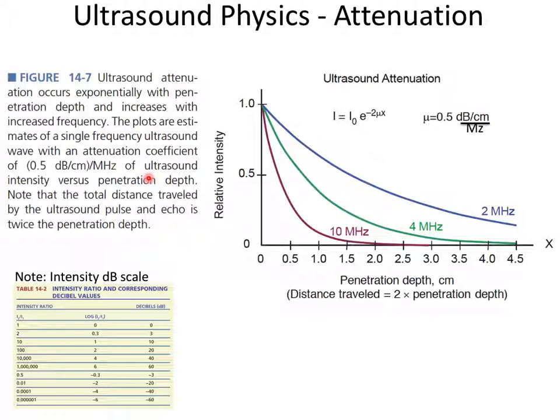And when you're reading about ultrasound and a number of other things as well, because these amplitudes go in a kind of logarithmic fashion, sort of in factors of 10, as you're moving through the sample, they're often reported in decibels. Here's the decibel scale, which you should know just for living, if you haven't already learned it in engineering.